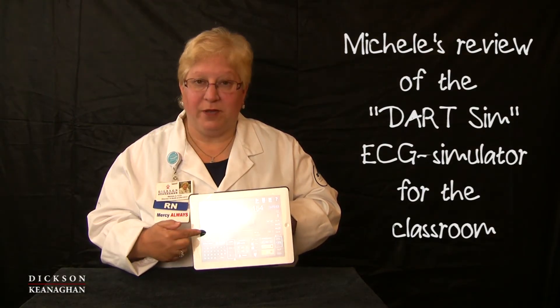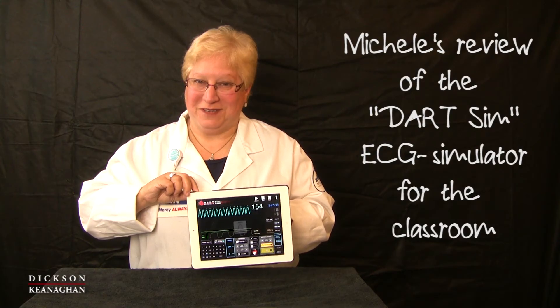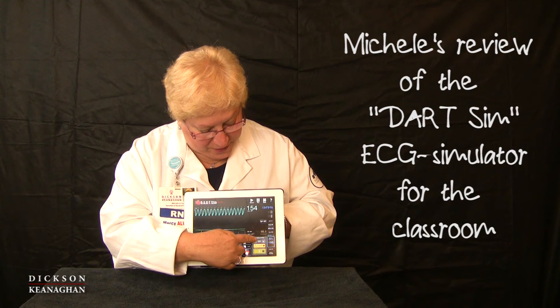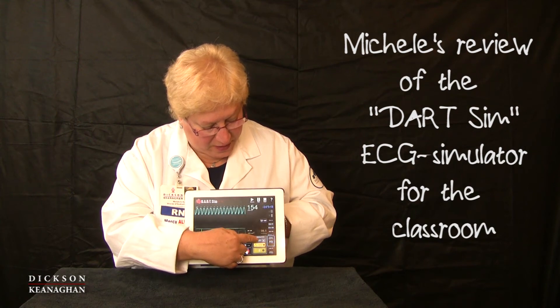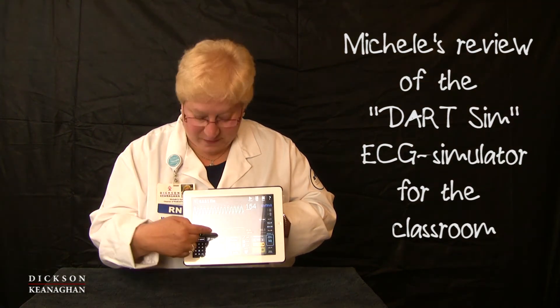There's a sync button that flashes on the R-wave. It has opportunities to change the joules — so if I'm at 150 now, I can go down to 50 — synchronized, charge it up, I'm clear, oxygen's clear, three we're all clear, shock delivered.